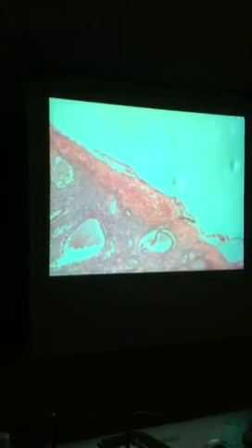All right, for the menstrual stage, this is going to be a little easier because you should see blood cells in here. Should. What in the world? Okay, what we're looking at up here, you can barely see it. It's horrible. Is that layer there? Let me get a different one.